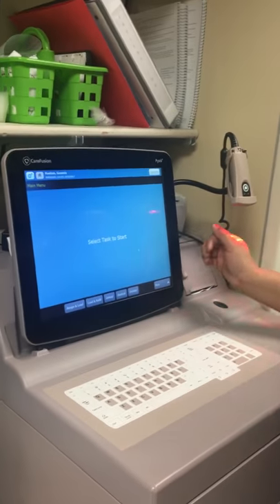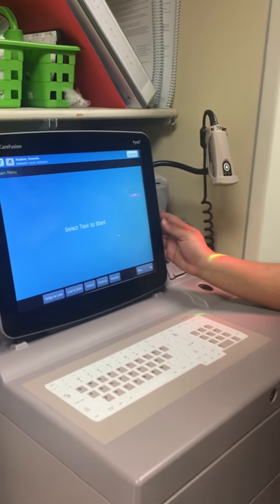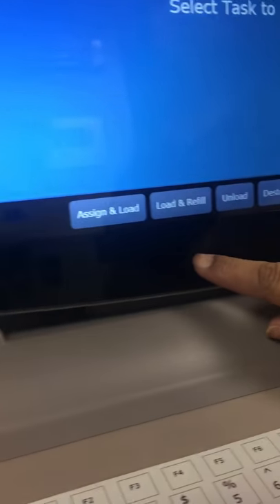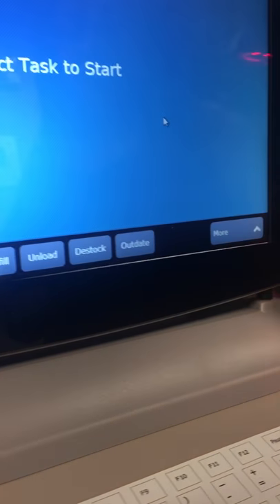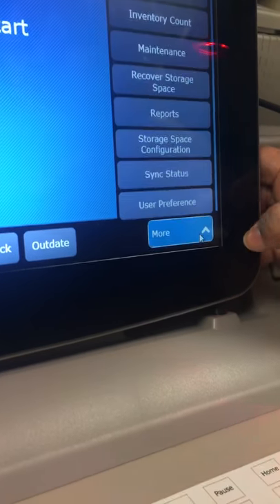This is our main menu — primarily what the technicians will be using. There is sign and load, load and refill, unload, destock, and outdate. There is also a more menu option which gives us various additional menus and options.